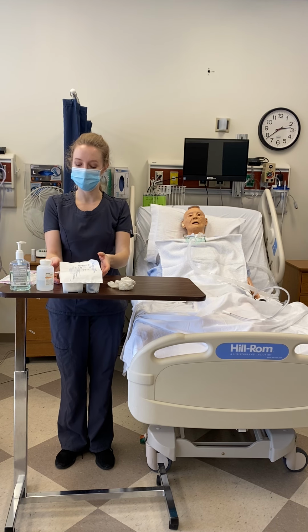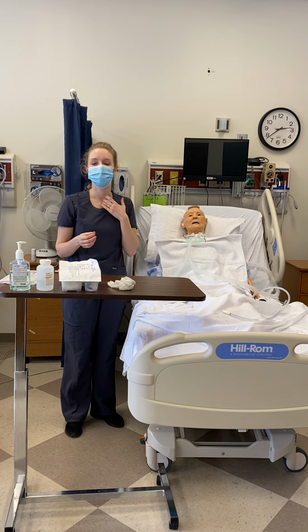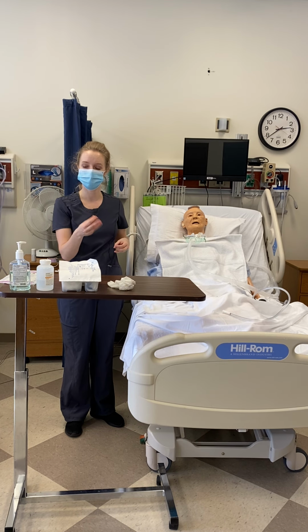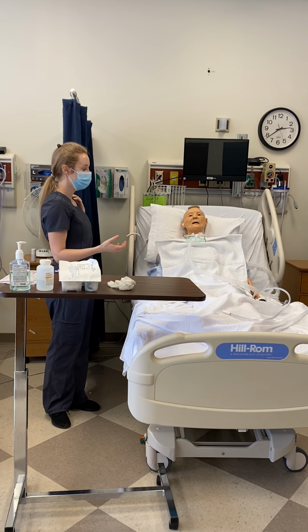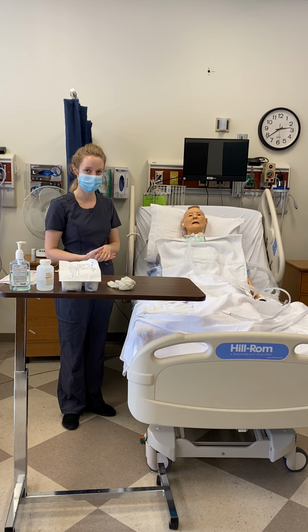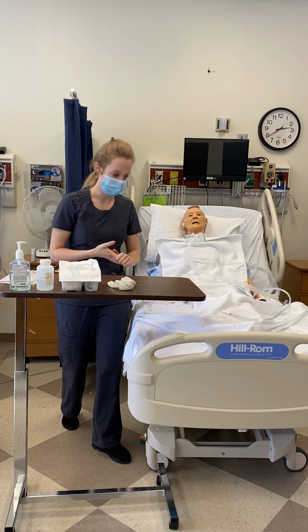At the bedside, when I'm providing trach care, I want to ensure that I have an obturator and inner cannula that is one size smaller in case Mr. Smith accidentally dislodges it. Again, I knock, introduce myself, perform hand hygiene, verify my patient, explain to him what's going on, ensure client privacy, make sure he's in semi-Fowler's, give him a towel, and hyperoxygenate him prior to the procedure. Once all that is done, I get ready to go.